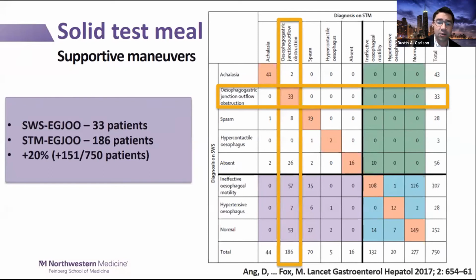And ultimately, the consideration for mechanical esophageal obstruction, particularly if LES relaxation is normal on these single water test swallows, should be considered, as does pressure artifact.